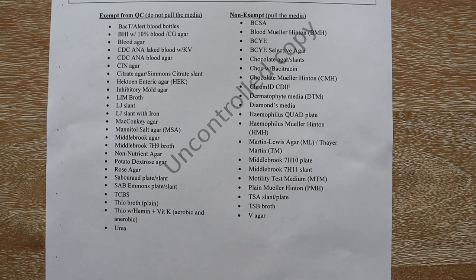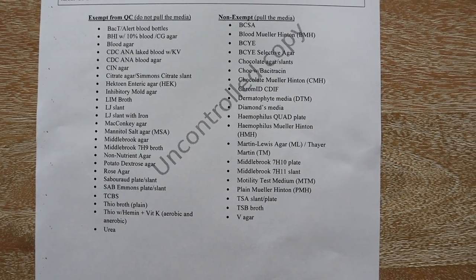And the whole reason you have that difference is CLSI, the organization, has said that your exempt media have less than 0.5% QC failure rate, so you don't need to QC them. And then your non-exempt media, their failure rate is greater than 0.5%, so it's deemed worthwhile to QC them.